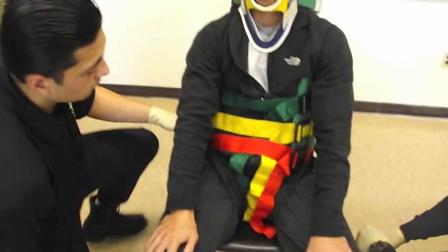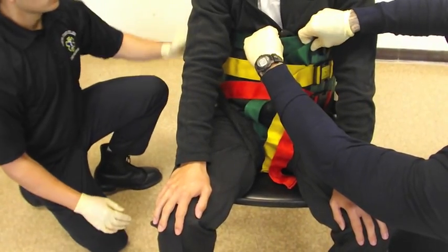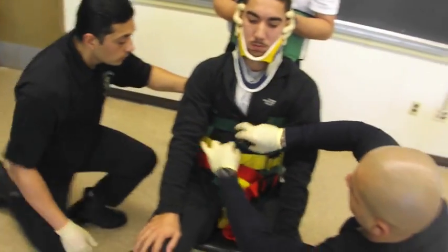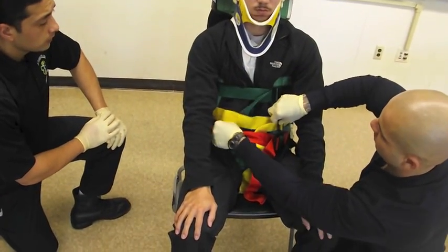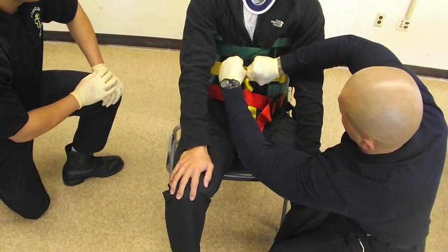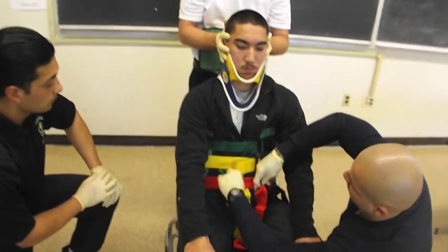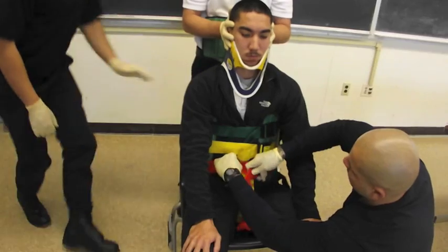Now with that strap down, they're going to go back and reassess their torso straps, because as you can see there's quite a bit of space between there. Louis is going to use the cross-threading method again, after telling the patient to take a deep breath, and he's going to make it tight enough so he can squeeze two fingers in between. He'll continue that with the other two straps.